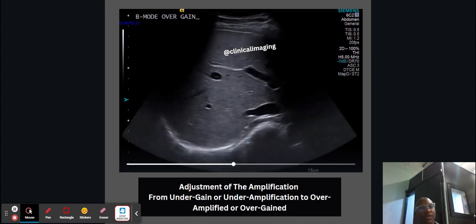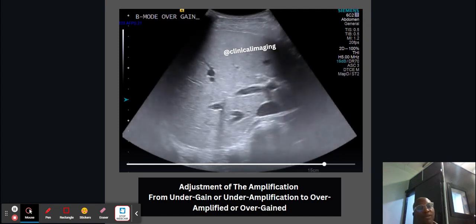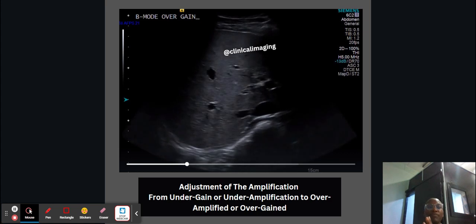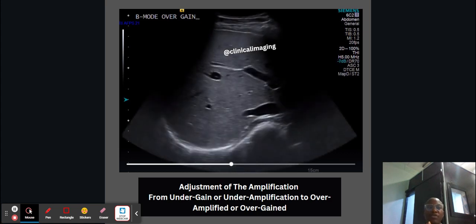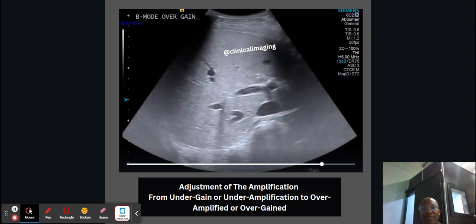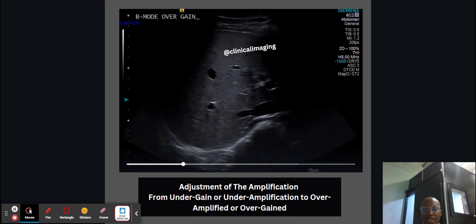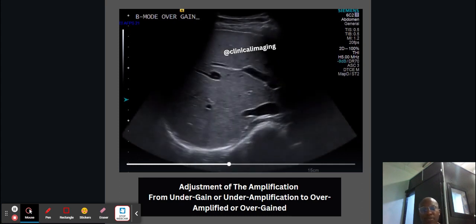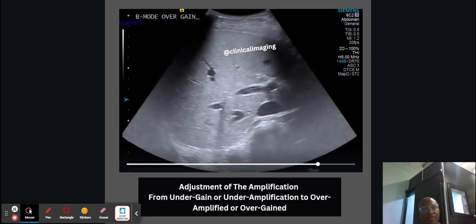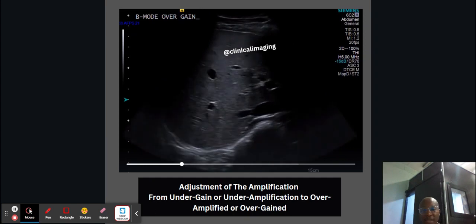Somewhere around 0, -1, -2, -3, between -5 to 5. In this range, you have to find an optimal balance, which will give you the feel you need for your image. For this one, we are going from the under gain to the over gain.